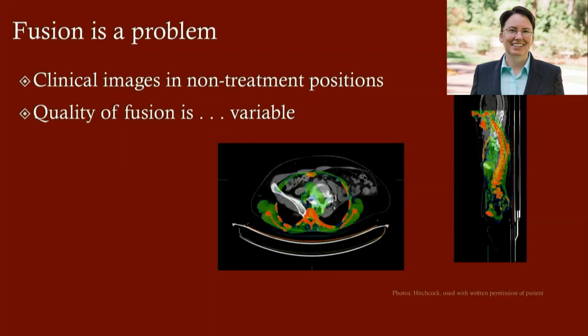And what that means is that the spatial resolution of the information that you're trying to get into your brain is not very good. And also that you're going to struggle to try to correct these problems in trying to actually use this imaging to treat your patients. And you don't need either of those things in your life.